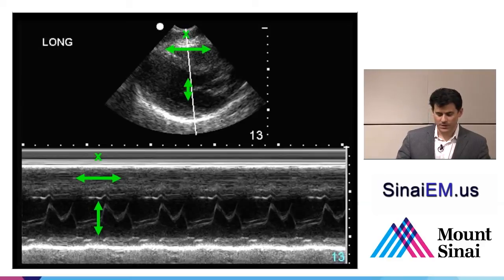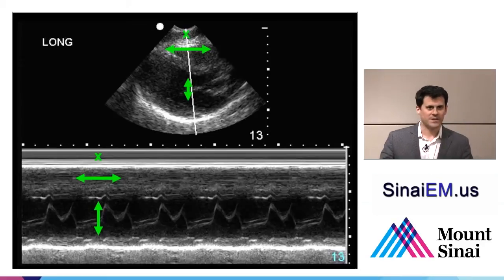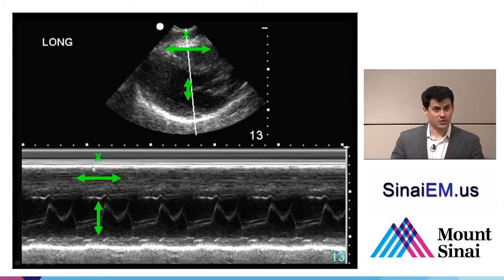So let's plant this idea now so you understand M mode in general, what the different types of motion. No motion at the top of the screen, side-to-side motion in the middle of the screen, and towards the bottom of the screen we have up and down motion. Most people look at M mode, they focus right on the up and down motion. And that's fine. There's a lot of incredibly useful information you can get from that.